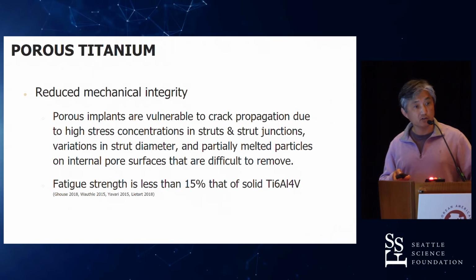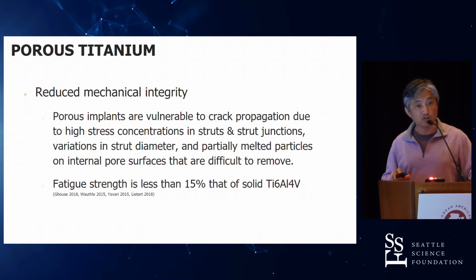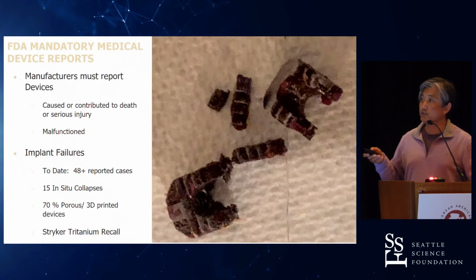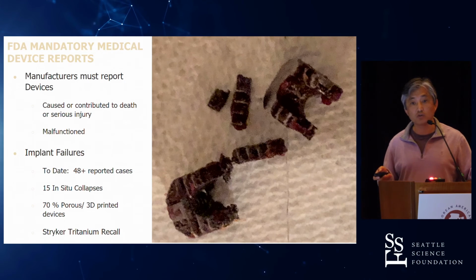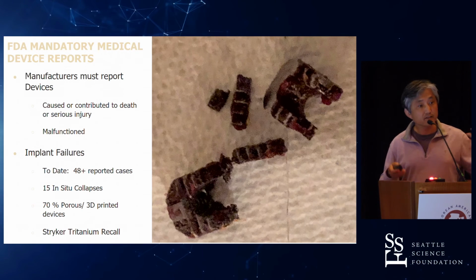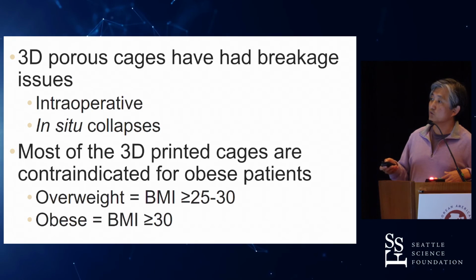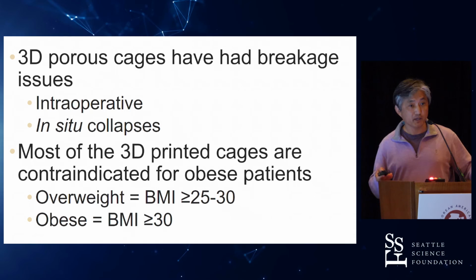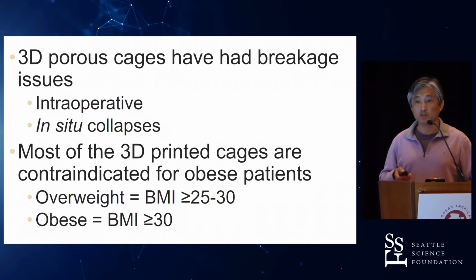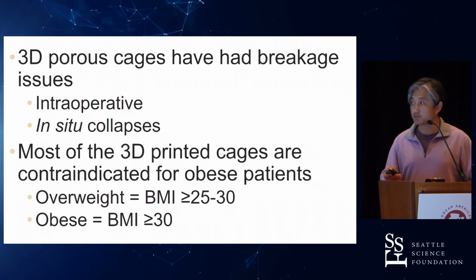And then lastly, there are some reports coming out that these 3D titanium cages are not nearly as strong. Therefore, there are some breakages occurring, to the point that there are reports of about 50 cases or so where the cages broke. The majority of them were porous 3D printed devices, and one of the companies even had to do a recall of their titanium 3D printed cages. It has also been recommended that in obese patients, which is almost all my practice, you shouldn't be using these 3D printed titanium cages, because they tend to fail either intraoperatively or later on they break and collapse.